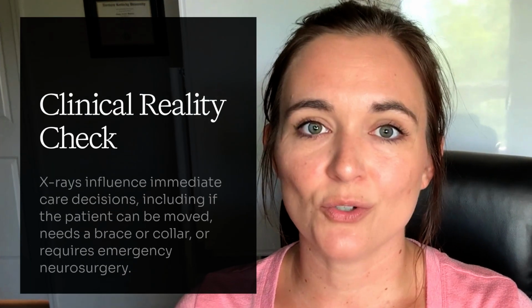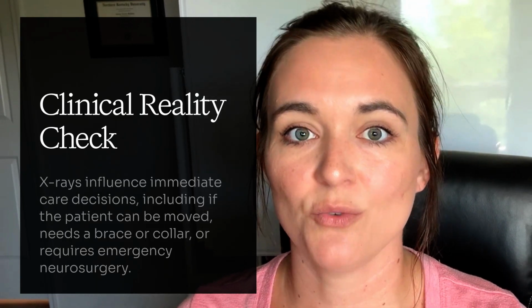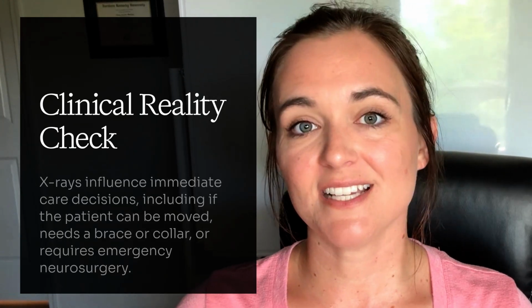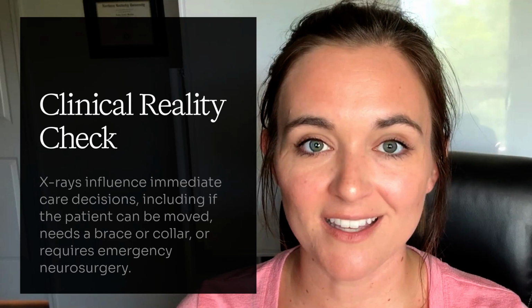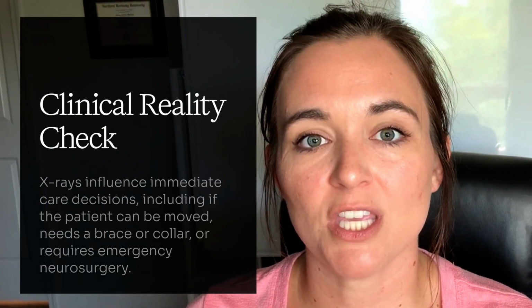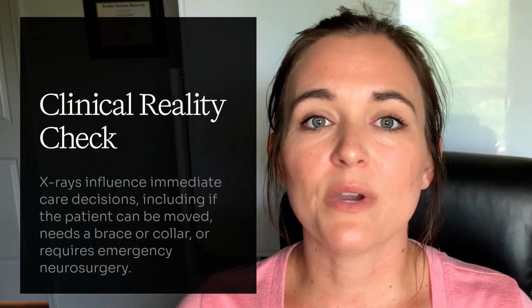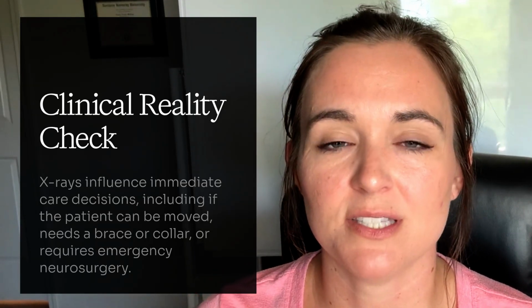And here's a clinical reality check. Even if a CT scan is ordered next, which it often is, these x-rays still matter. Why? Because your x-rays are what we base immediate care on. Whether the patient can be rolled, whether a brace or collar is needed, or whether emergency neurosurgery should be on standby. So don't think your trauma views are just a formality. They often make or break the next decision in care.